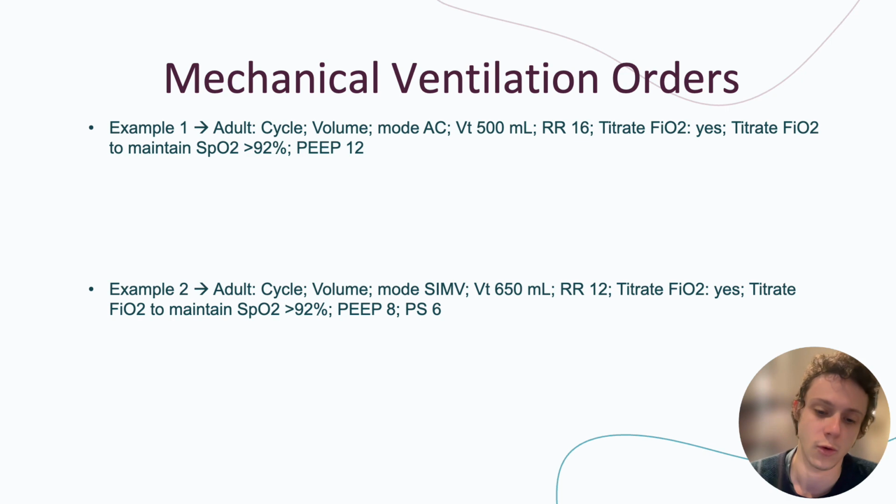So this is maybe an order you might see in someone who just got intubated, right? They have a higher PEEP. They're on an assist control mode. They're not quite able to control their own volume of breaths, but they are able to maybe breathe a little bit on their own and get delivered the full volume.